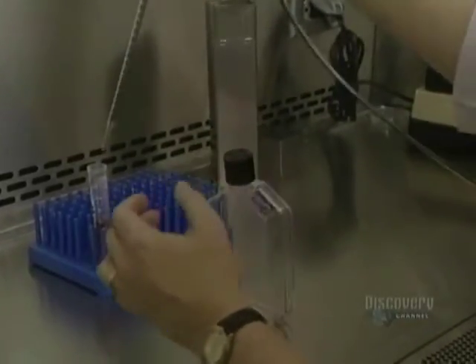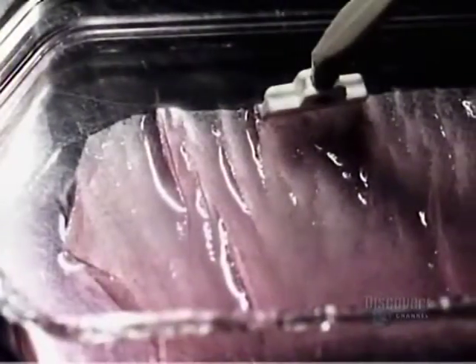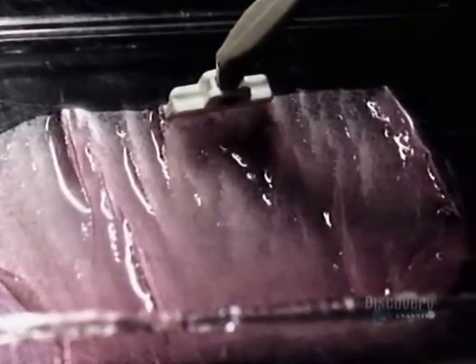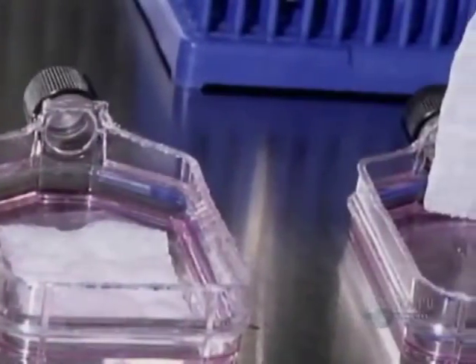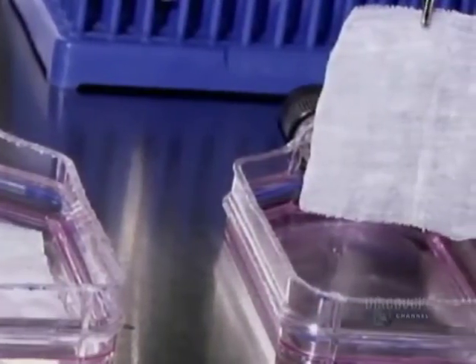Skin strips coat the inner surface of the flask. They are then detached with a spatula. The flasks are cut in two with a heating unit resembling a soldering iron. To make handling easier, gauze is placed on the skin strips, whose thickness is less than one-tenth of a millimeter.